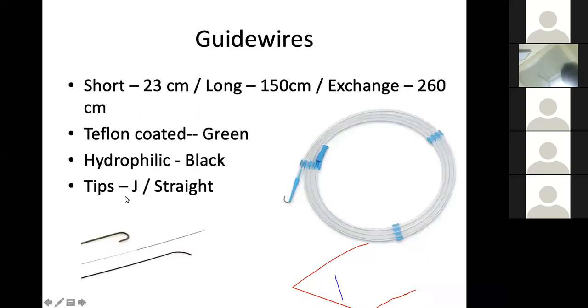In this example, these are the regular angiographic guide wires. The thin wire that you see, this is what is a micro guide wire. A micro guide wire would be very, very floppy and would be almost as thin as a hair.